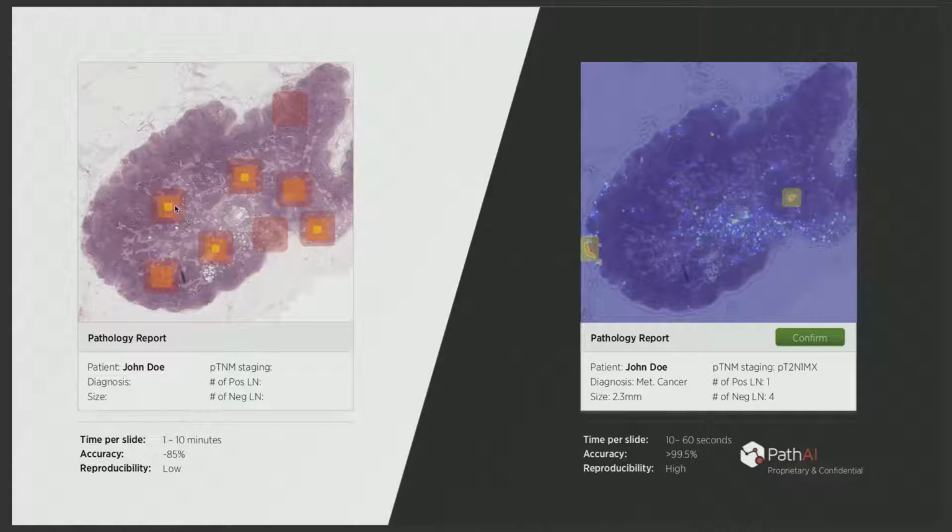They have to manually add the distances of the cancer in those two regions. And then they have to put this into a staging system that incorporates how many areas of metastasis there are and how big they are. And all of these things are pretty much automatable.